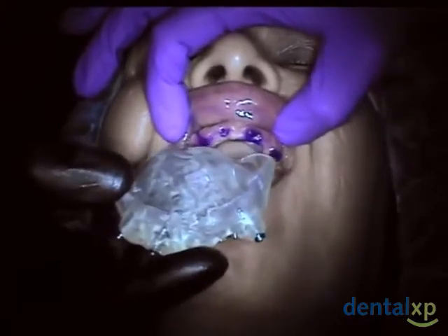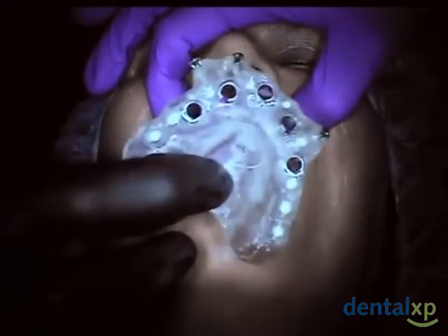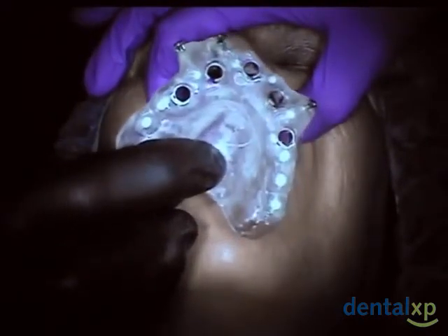What we're going to be doing this morning is five implants on the upper and five on the lower to ultimately retain her upper and lower denture. We did a surgical guide based on the CT scan — this is the appliance created from the software treatment plan, which came from the CT appliance she wore during the scan. We have to retrofit her existing denture, so we'll do some of that as we're doing the surgery and start by placing our surgical guide.